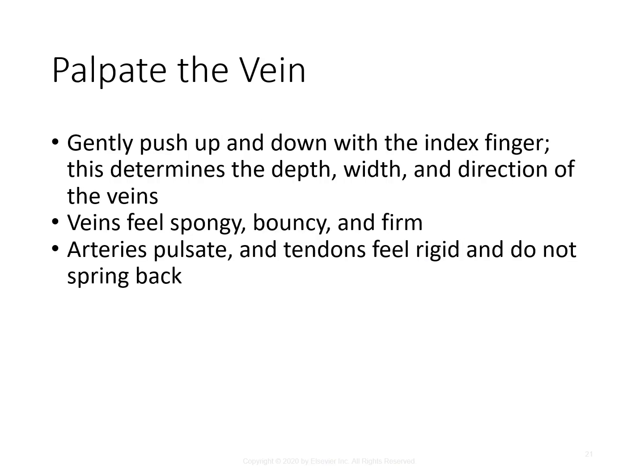You are going to palpate the vein to try to locate it. Trying to locate a vein is best by palpation, or feel, rather than by sight. You can see a vein sometimes, and that may not be your best choice once you touch it. Once you get to your clinicals and you're feeling around on veins, you'll know what I'm talking about when I'm saying it's bouncy. It's going to feel spongy. It's not going to be hard, and you'll know what I'm talking about.